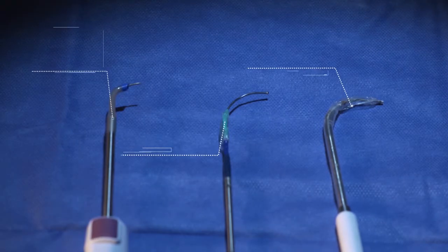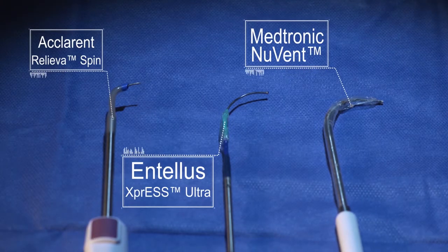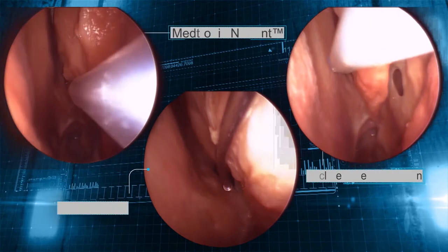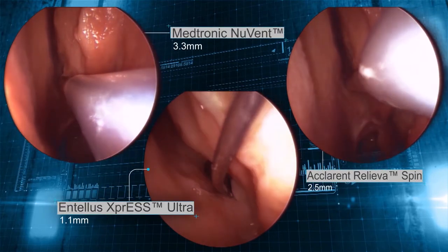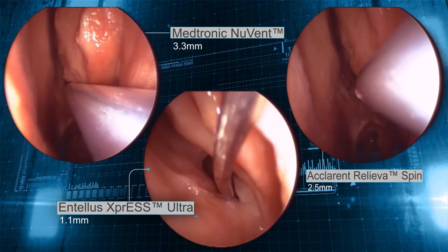Welcome to the Sinus Science Center. Your field of vision impacts how quickly and confidently you can identify, access, and treat the sphenoid sinus ostium. The three devices used for office-based treatment may appear similar, but the differences in diameter can have a big impact on your field of vision during an endoscopic procedure. In fact, the difference in size between systems can be as much as three times.